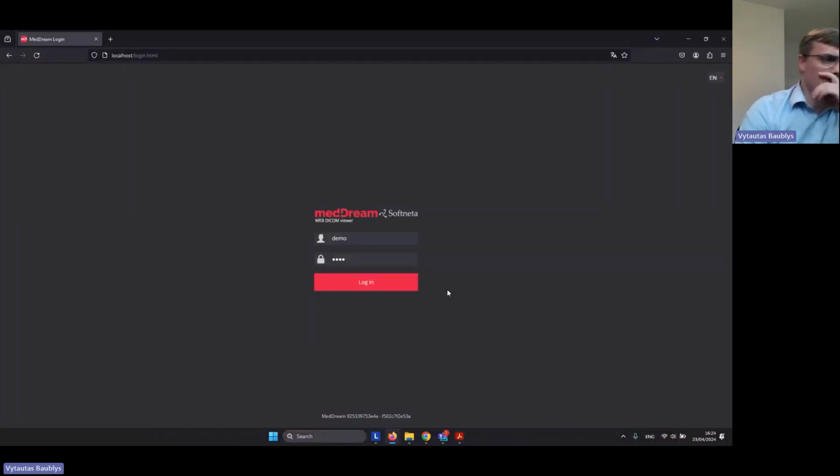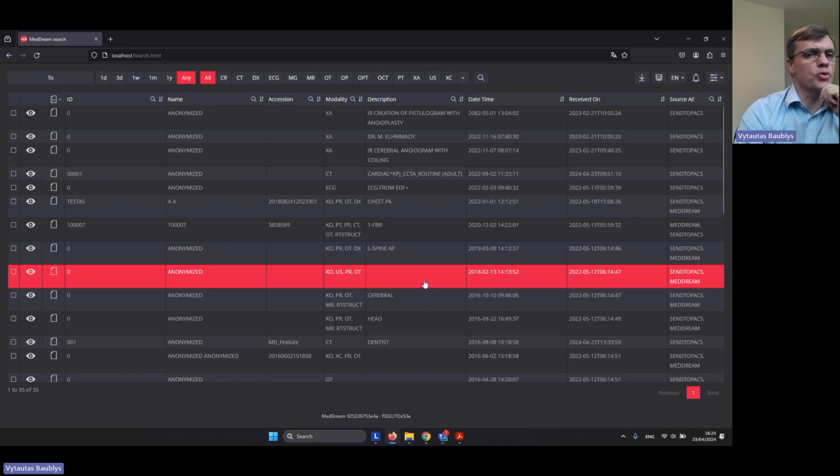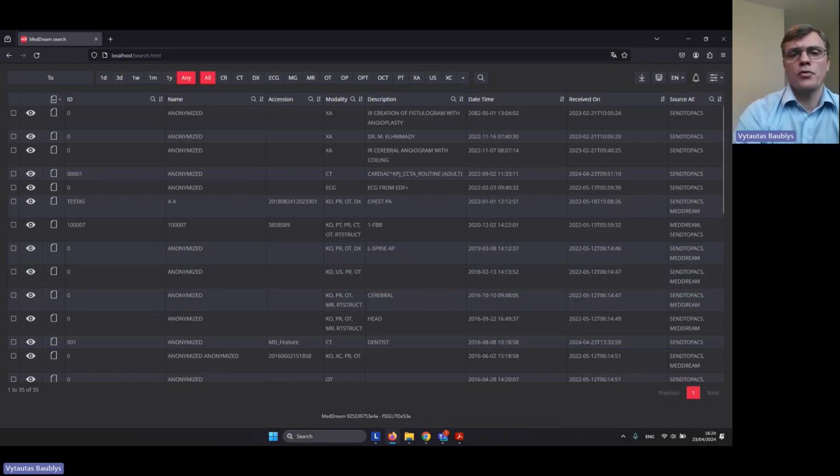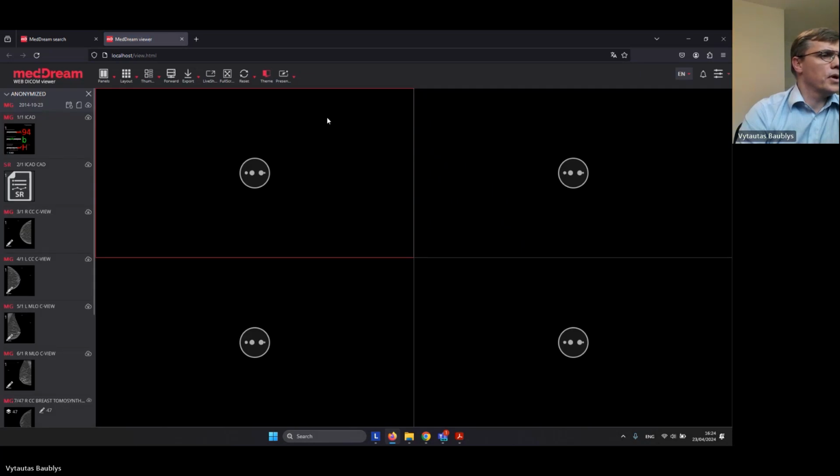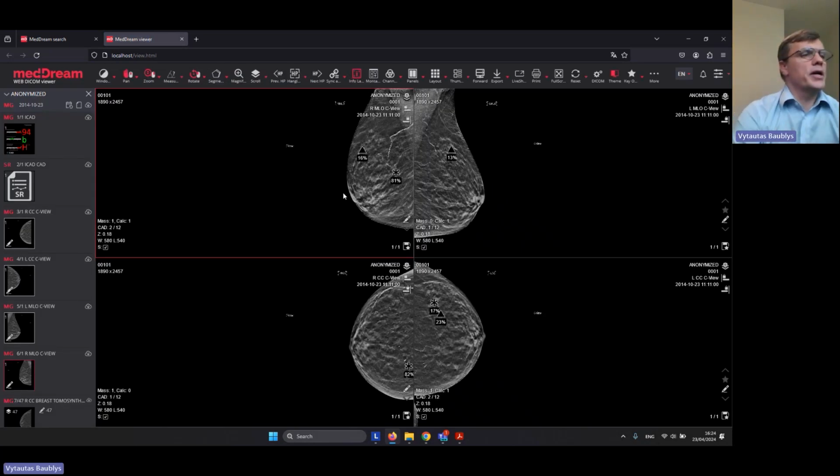So I just updated my system today to the newest version, and let's go first, as I presented, to the MAMO view. So let's select MAMO. Yes, so I opened this MAMO. As you see, my MAMO is covering some patient data, covering my view. So how can I uncover it?